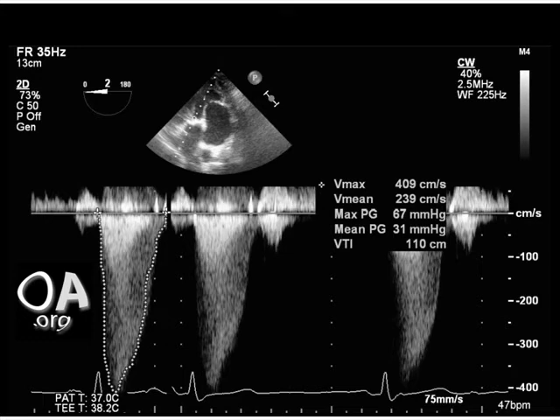This is the VTI at the level of the aortic valve, again in the deep transgastric view, using continuous wave Doppler, which samples at the highest velocity along the Doppler beam. The stroke distance, or VTI, here is 110 centimeters.